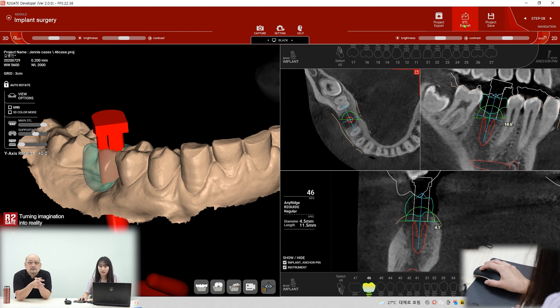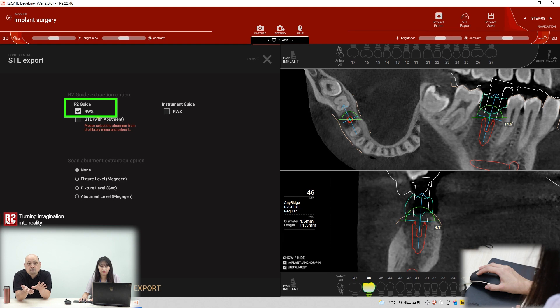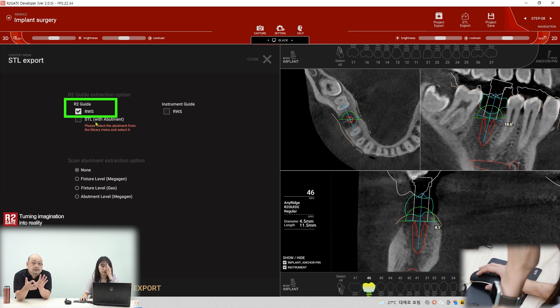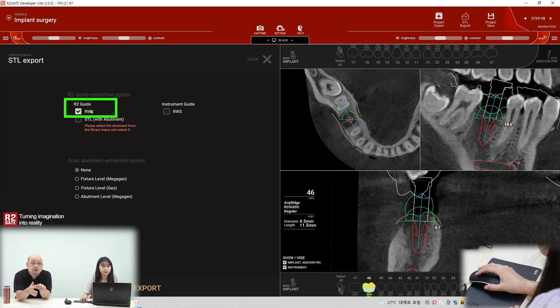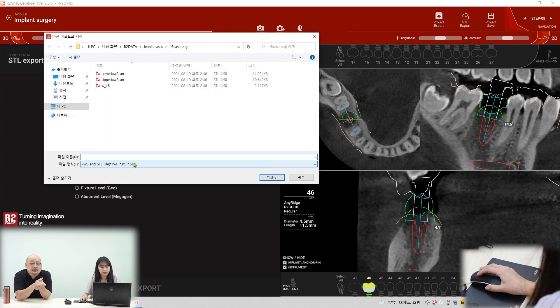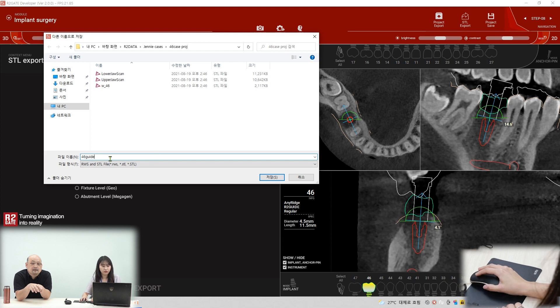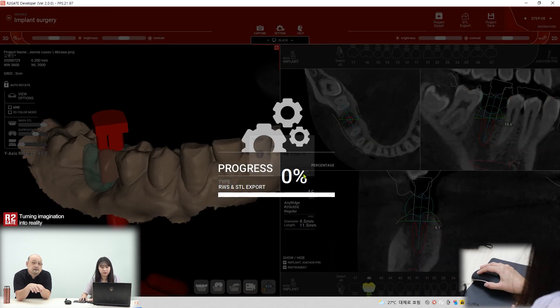That is the STL export option, and there is also an option for the R2 guide — the RWS format. That's a special format, so if you want to use the R2 guide you have to export it to RWS format. The STL with abutment option is for other CAD software. At this time we only need to check RWS and export.